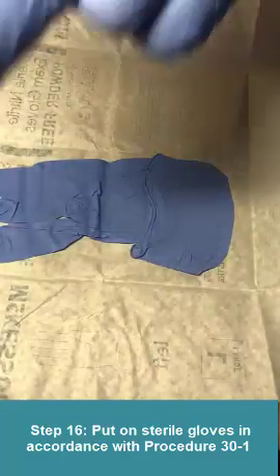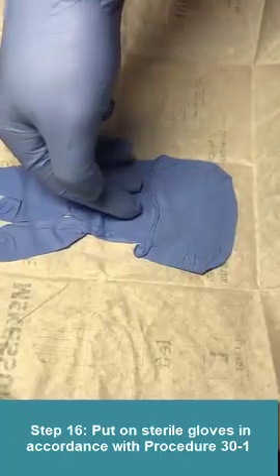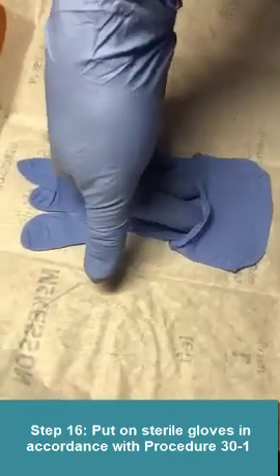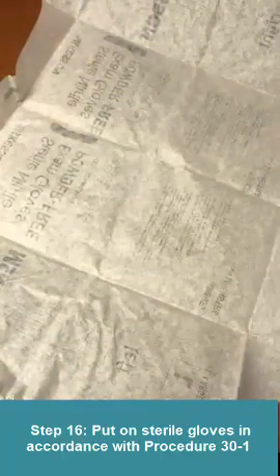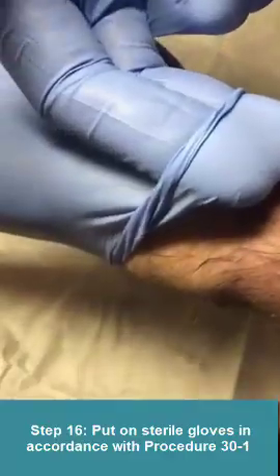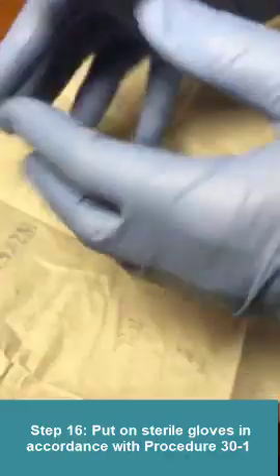So now with the dominant hand, I'm going to take 2 fingers and put it under the cuff. So I'm touching only the sterile part of the glove now. Flip it around and put it on as before. And again, my fingers are still on the underside or the sterile side. So now both sides are sterile. I can tuck fingers together to get a better fit.